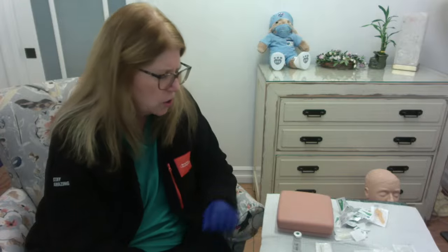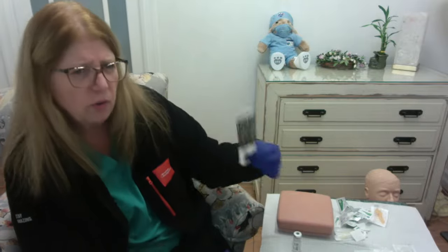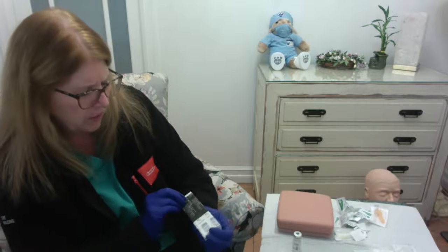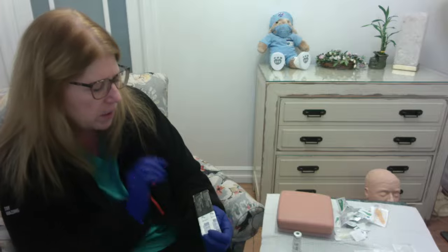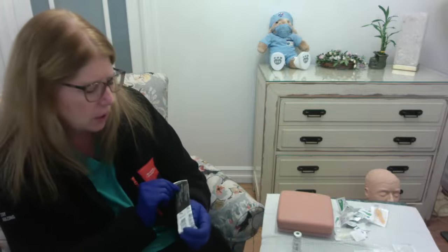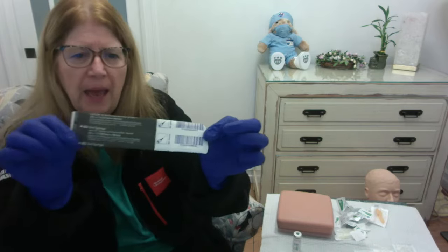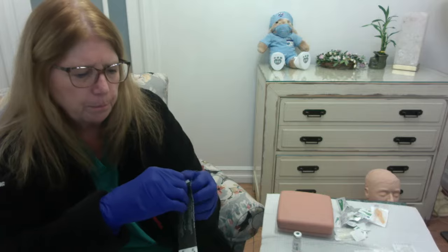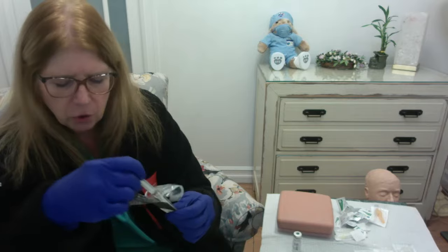So here we're talking about gauges that are anywhere from about 21 to 23, roughly. Okay, 21 to 23. And I've posted something for you with all the gauges on it. All right, so let's take a look at this syringe. So this, again, is a 3 milliliter syringe. It has a 22 gauge needle that is 1.5 inches long. Okay, so let's open this up and have a look at this.